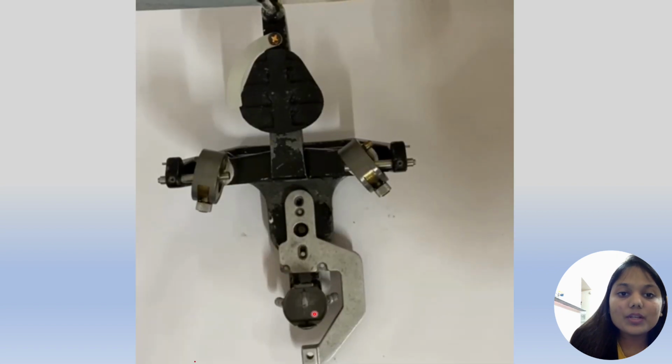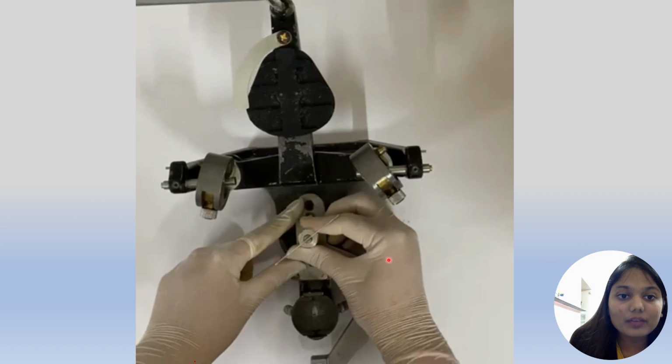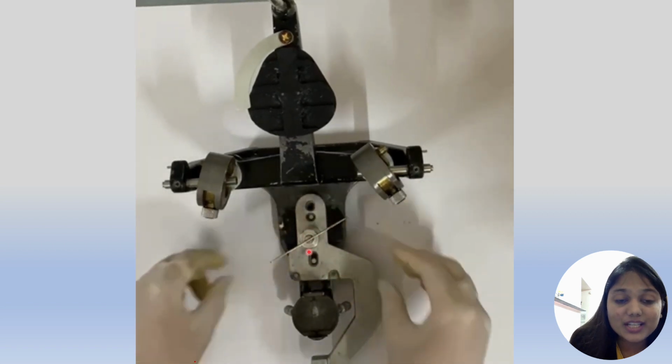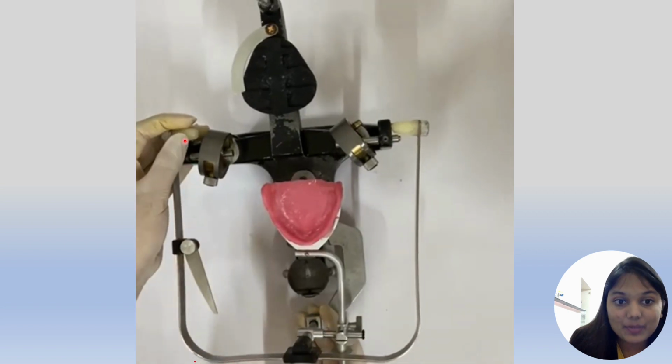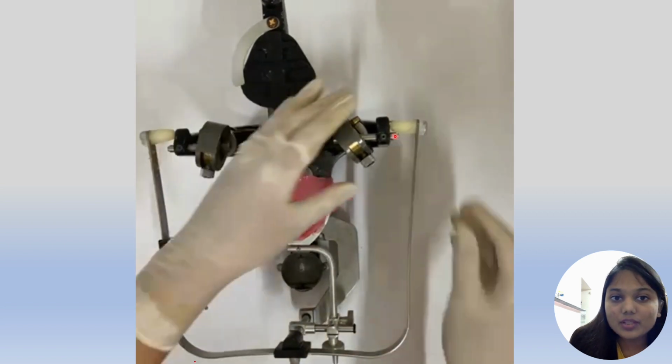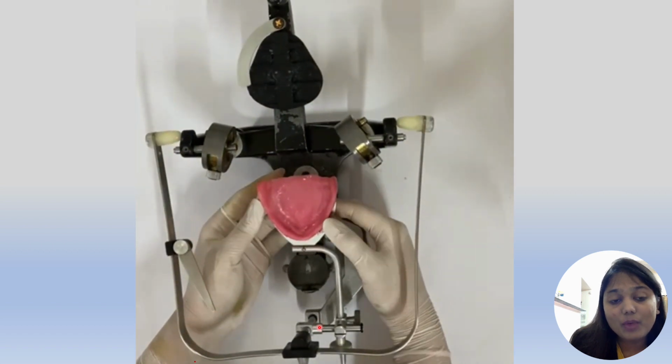So now we will use the Hanau articulator. This is the mounting jig. This is the Hanau articulator. We have this mounting jig placed on the patient, and here we will place the assembly. So these points are for the earpiece, and we have placed the central rod with the mounting jig.